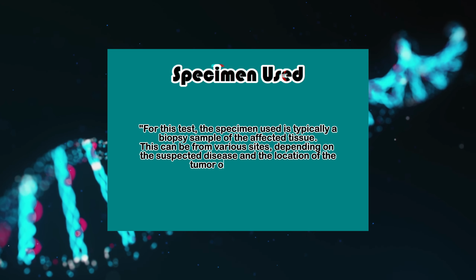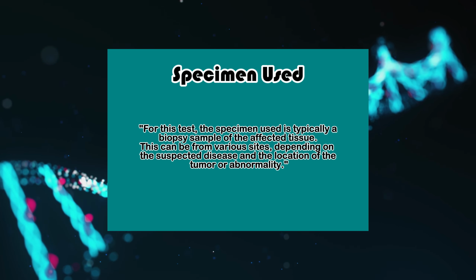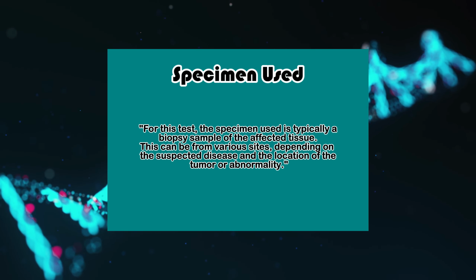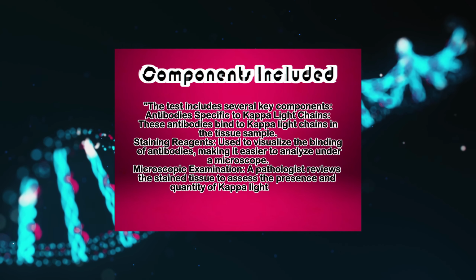For this test, the specimen used is typically a biopsy sample of the affected tissue. This can be from various sites, depending on the suspected disease and the location of the tumor or abnormality. The test includes several key components.